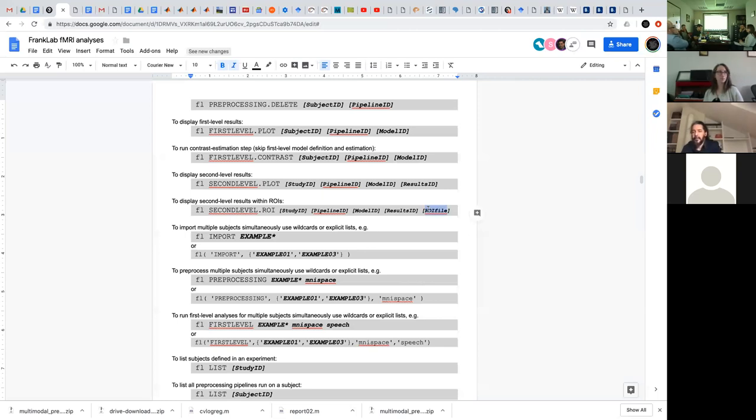This idea of weighted averages is pretty cool. So it would be weighted by the probability that it's actually that structure, say. Right? Is that what you're saying? Right, exactly. You have a probabilistic atlas where you have numbers that are ranging. Yeah, it's like this voxel is 70% likely to be the structure, and this other voxel is 3% likely. Then you would weight that.